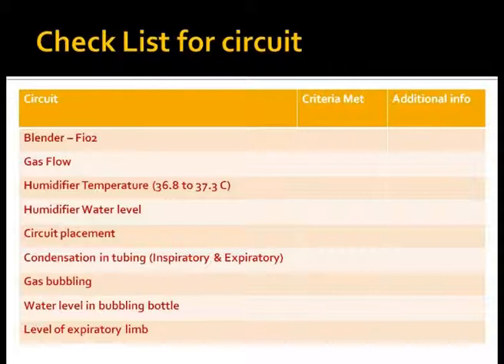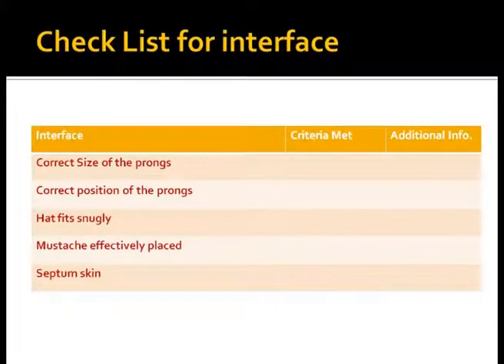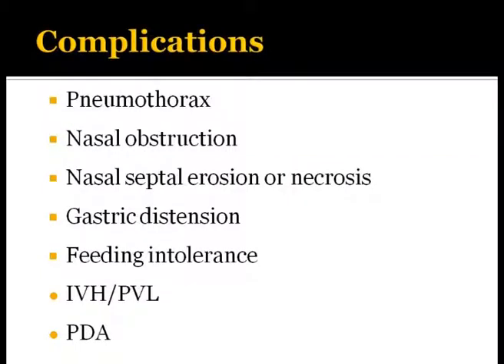Documenting each observation will help in ongoing assessment of the patient as a whole. Such charts are required to ensure smooth progress of a baby while on CPAP. A checklist should be in place to confirm meticulous monitoring of circuit and interface by all medical and paramedical staff in a uniform manner. Goal of monitoring is to judge the adequacy of CPAP and look for preventing complications of CPAP.